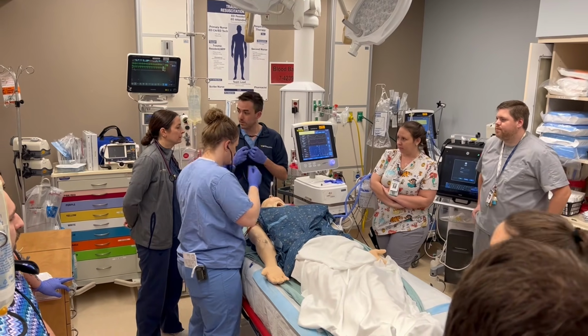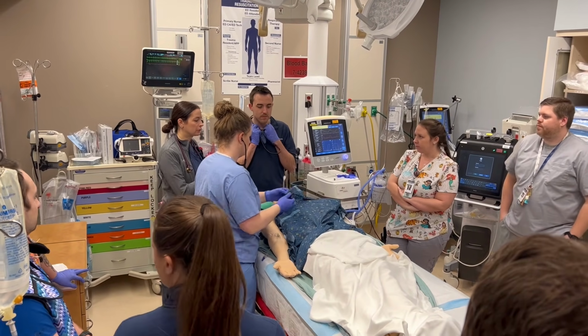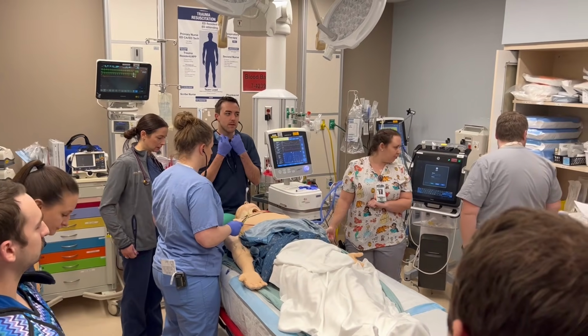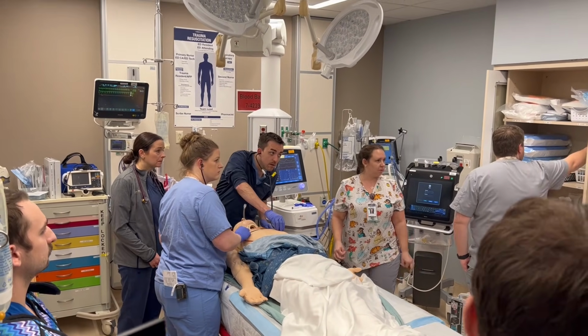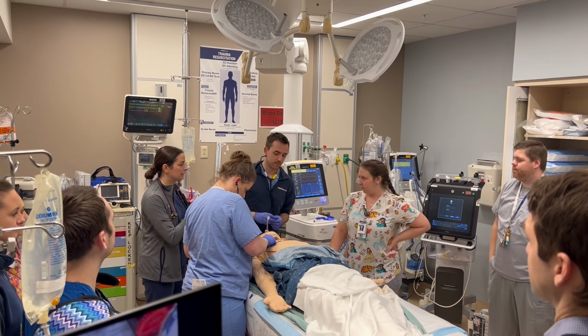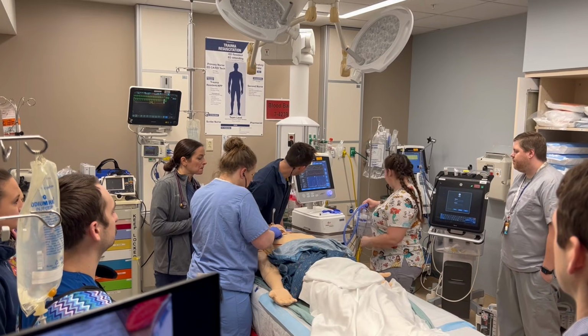So let's reconfirm our tube placement using ultrasound and troubleshoot our vent. We'll get a chest X-ray, and we'll listen to lung sounds here. You do have present and equal breath sounds, it's reading 55. And could we ask respiratory to just check that the vent's set up and everything looks okay on the vent?